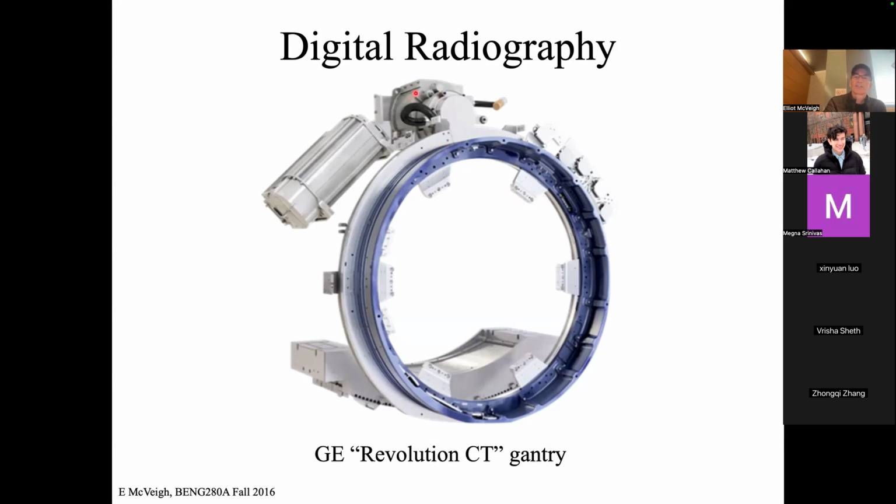So it's pretty fast for something that's very heavy. And the G forces for materials out here are sort of 50 Gs, 75 Gs, depending on how fast you spin the thing. So you have to build it pretty securely, because it's under a lot of force. And that's why big companies like General Electric, Philips, Siemens make these big machines.